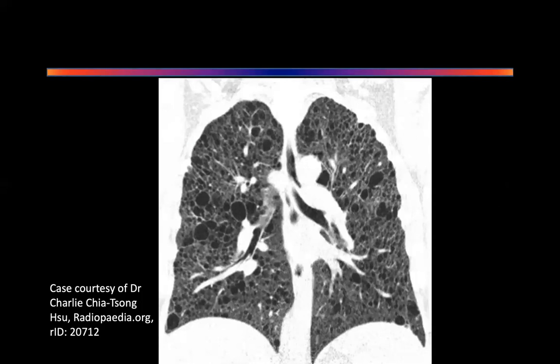Even before that, Vishwarup. Can I see an X-ray of the same pathology? No. Okay, that's acceptable. But this shot, what is wrong with this shot? Before you start reading this shot, what is it that you want to confirm? Labeling. Sir, there is no side mentioned, right? Identifiers. You have to look for identifiers.